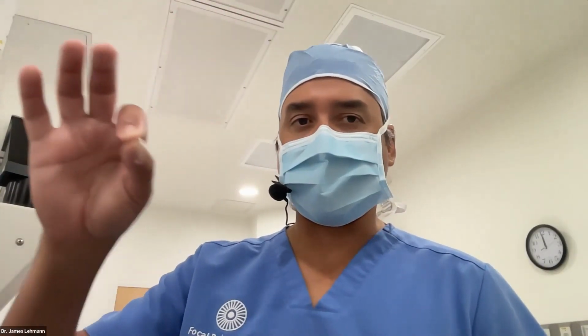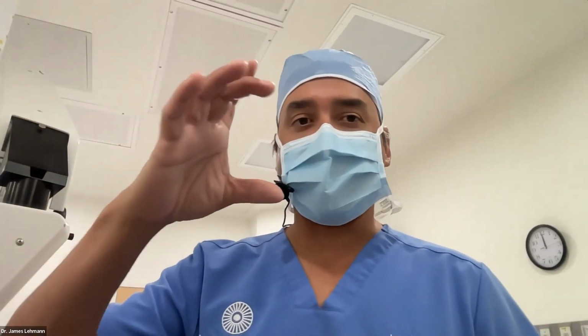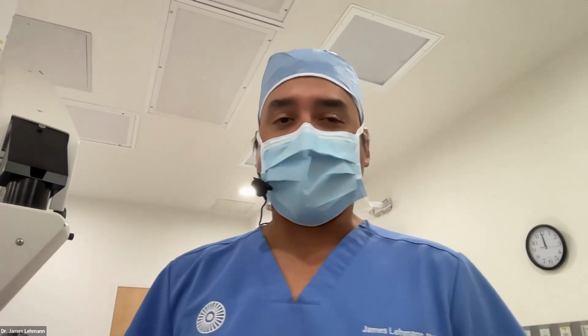Another thing that you demonstrated on the first case and also in your lecture was the orange peel technique. And Dr. Tariq Mohammed is asking, how can I enlarge a small Rexis? So maybe you can just talk about, as you're either intentionally having a small Rexis because it's a dense nucleus and you're worried about a run out, or other things, how can you enlarge a small Rexis in the middle of a surgery? If you've already started, it's a spiral technique. But if you've made a Rexis and it's too small, then that's harder.